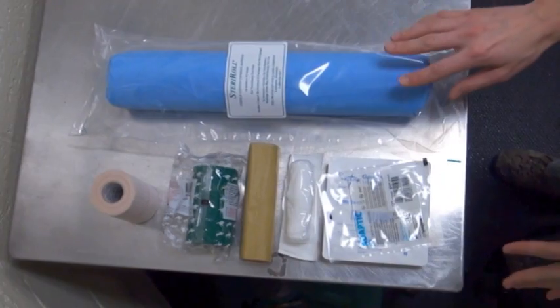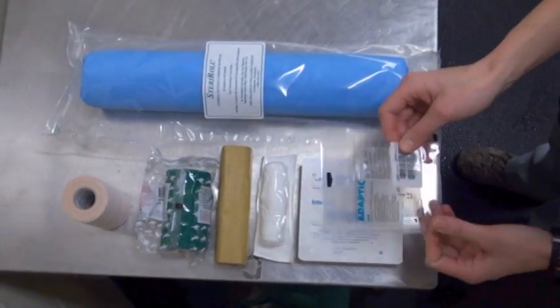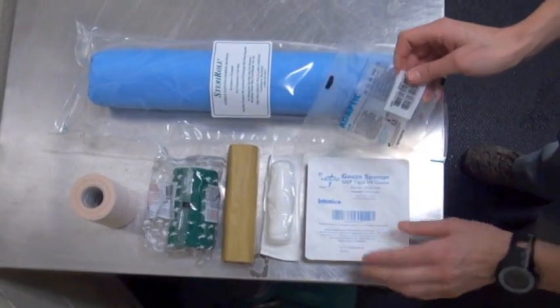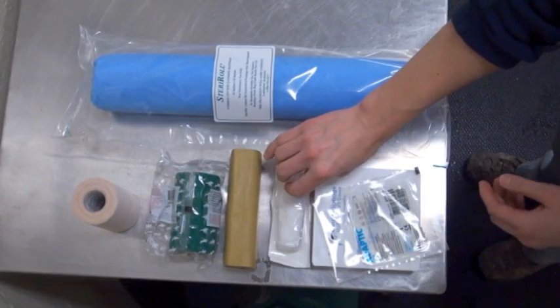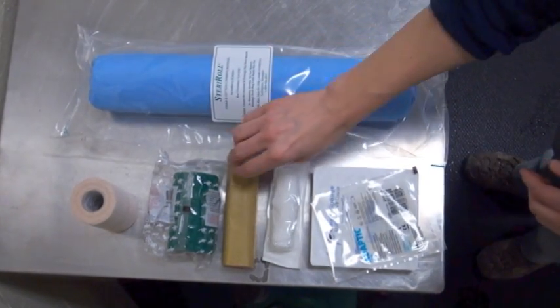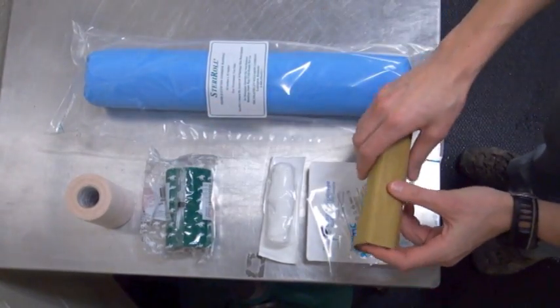So what you have here are the contents of the bandage kits that we send home in our equine bandage kit. So the first thing you'll have is your non-stick dressing. You also will get a pack of gauze sponges, a small roll of gauze, a sheet cotton, a brown gauze, a vet wrap, and an elasticon.